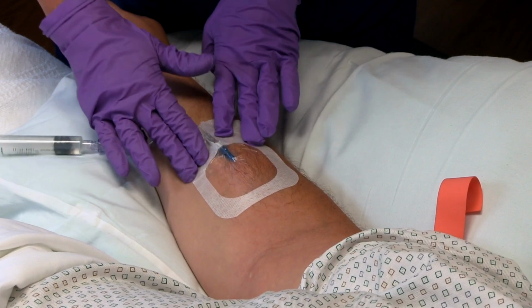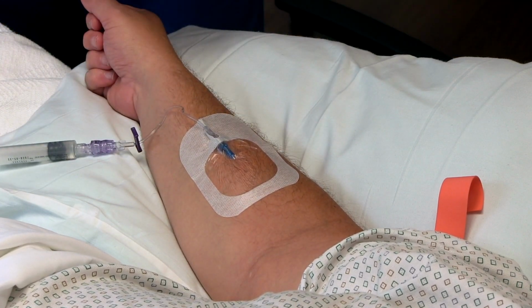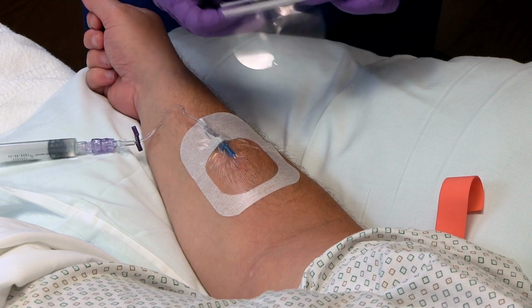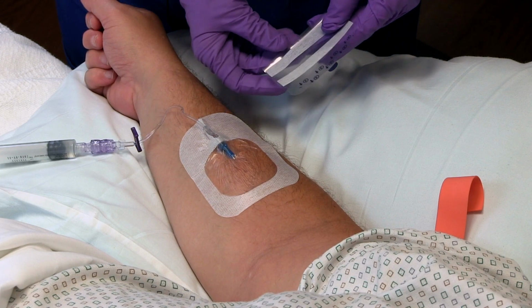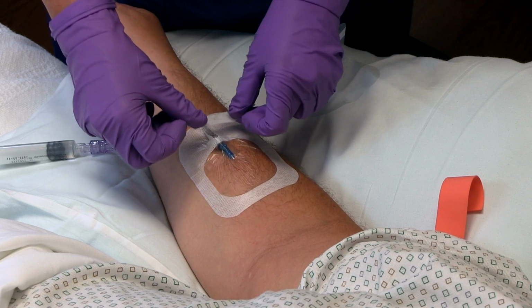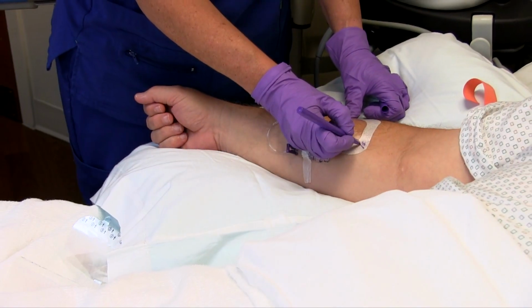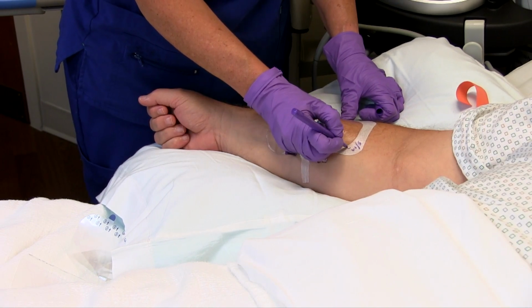Press the dressing over the IV and tubing. Use the split section to cross under the tubing and adhere to the skin. The additional adhesive strips can be used over the catheter hub and tubing. Document the date of insertion on the outer dressing and in the patient medical record.